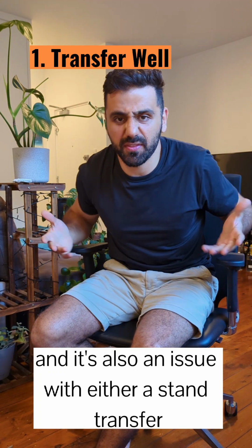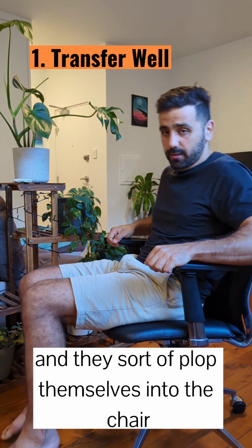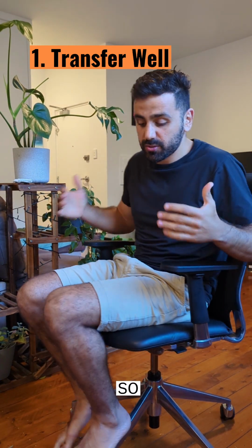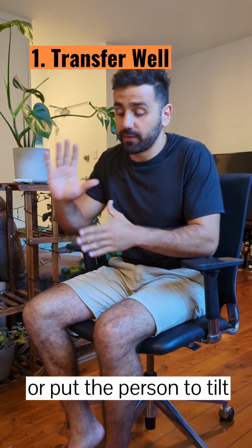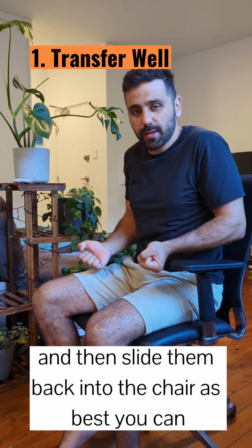And it's also an issue with either a stand transfer where someone's standing and they sort of plop themselves into the chair, or a slide transfer where they're sliding across and then that's it. So before you get started, what you want to do is ask them to either reposition themselves by pushing onto the armrest, or put the person in tilt and with 1 or 2 person assist, grab their bottom and then slide them back into the chair as best you can.